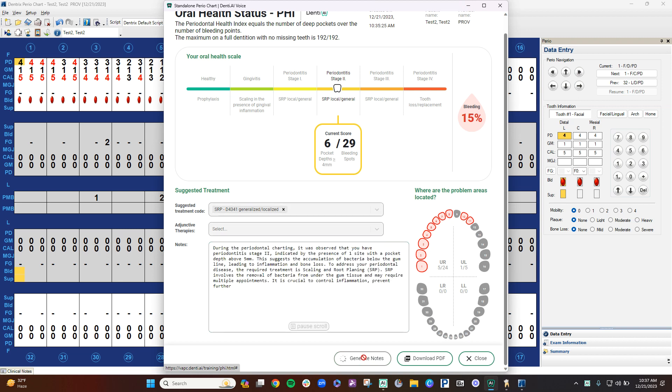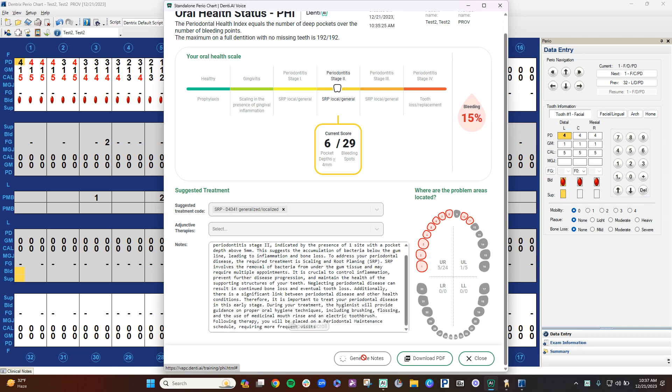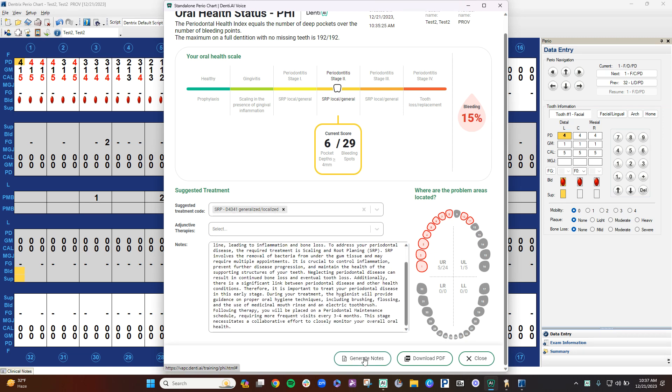And then once this is done typing it out, you can download it as a PDF. Once you download it as a PDF, you're able to save it to your patient's chart or you can print it to your patient. The other thing you could do is send it in as an insurance narrative if you want to use it for the D4346 code. So this is a brief demonstration on how to use Denti AI Voice within Dentrix.